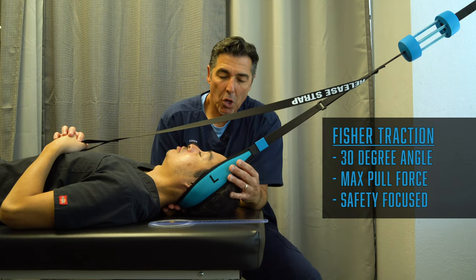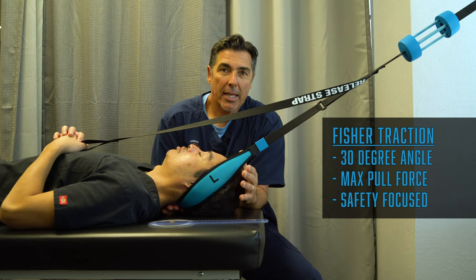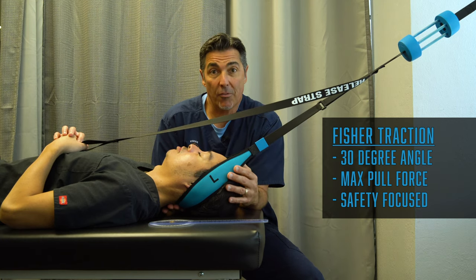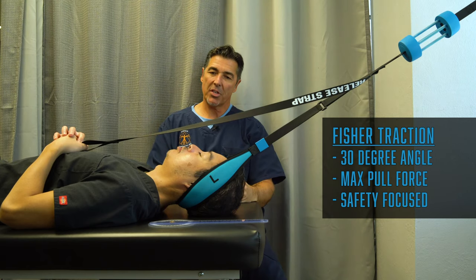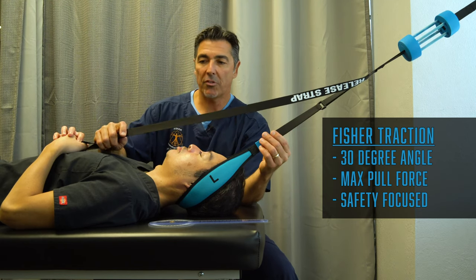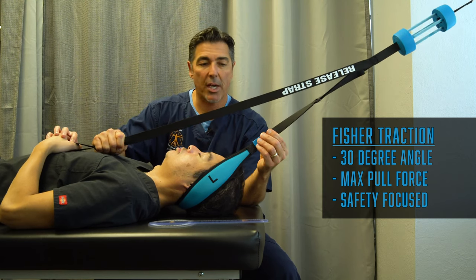Research studies have shown that when you have curve in the spine during traction, your benefits are greater — both for the low back and for the neck. That angle is perfect. You can see the curve in his neck is fully maintained, and at this angle with this pull, he's able to use his release strap for the decompression process.